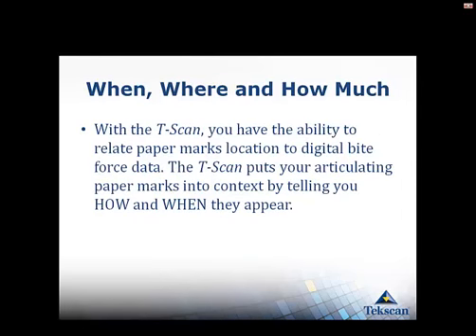So what we're looking at is with TScan. TScan doesn't replace our traditional means, but what it does is it puts your articulating paper into context. So when you're looking at all those marks, it tells you when that mark came in and how much force is on that mark. And that's been really helpful in our dental practices that are using TScan.